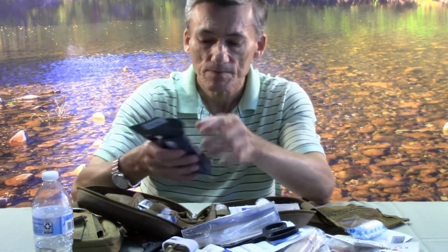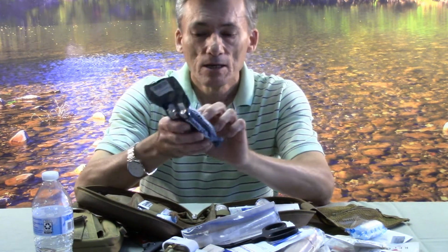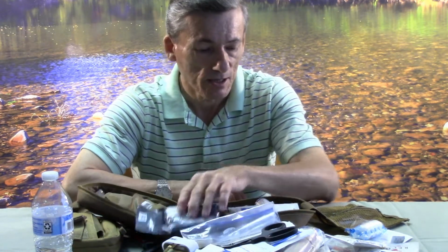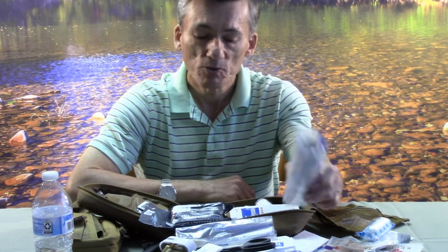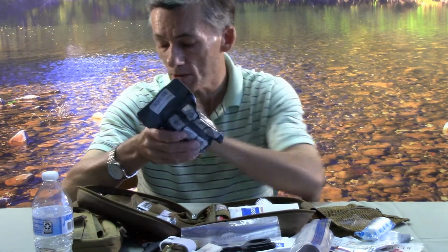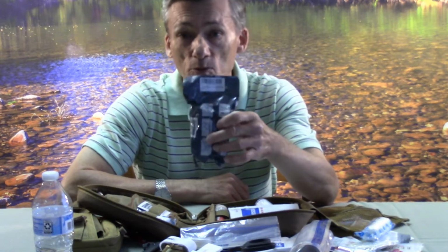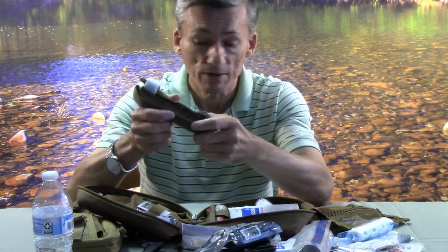Something else that I have here in addition, and I'm not going to rip it open because it's the only one I have left right now. This is an Israeli bandage. This actually can also serve as a makeshift tourniquet. And it's got other purposes as well. It's a bandage. It basically can do the same thing as this gauze here, or the Ace bandage rather, only better. It's got a little system there where it will actually secure itself to itself. Like I said, you can also use it as a tourniquet. But it's rather difficult to apply a tourniquet to yourself, and that's another advantage to this type. You can actually apply it on yourself, and I'm not going to get into that right now.